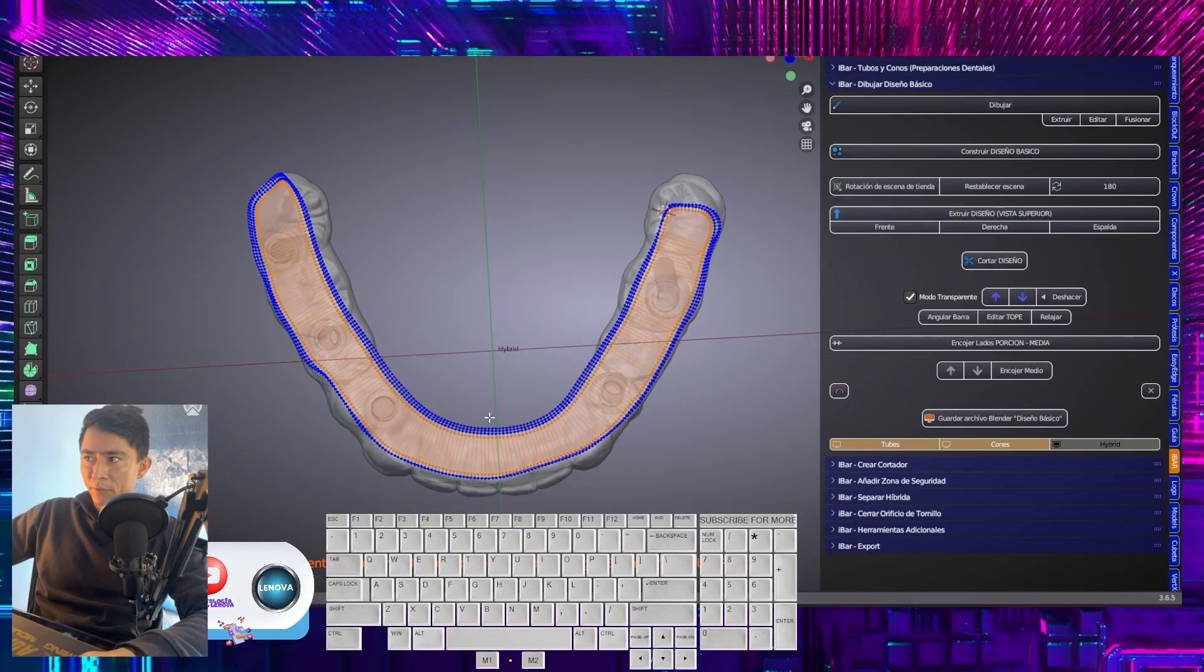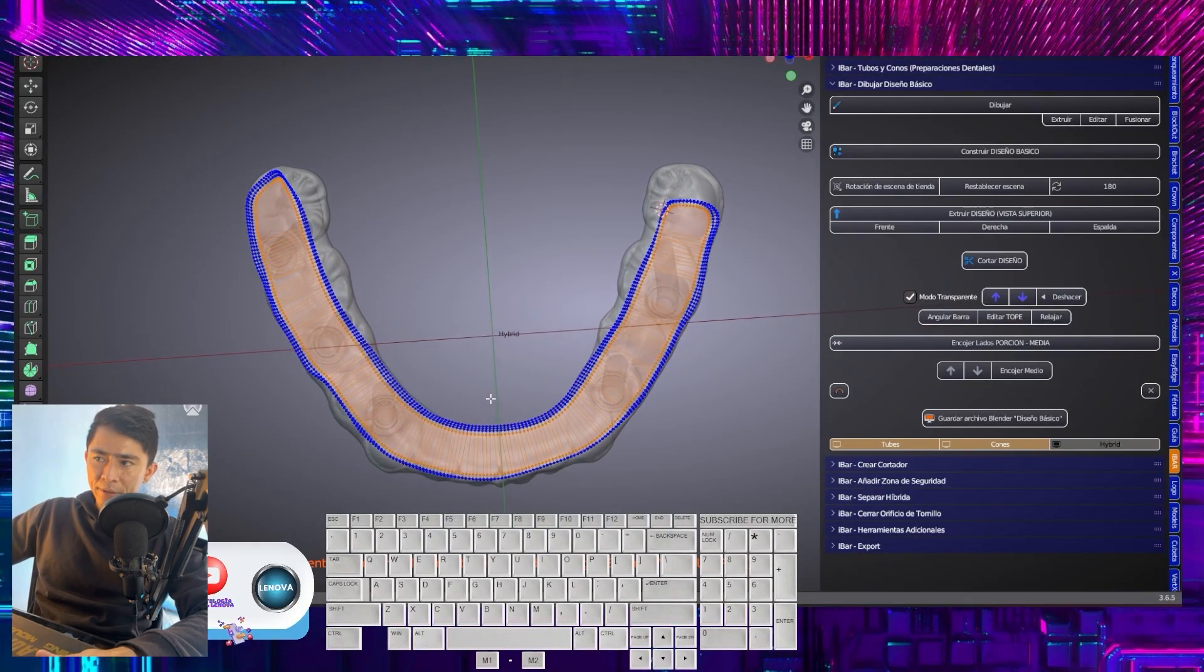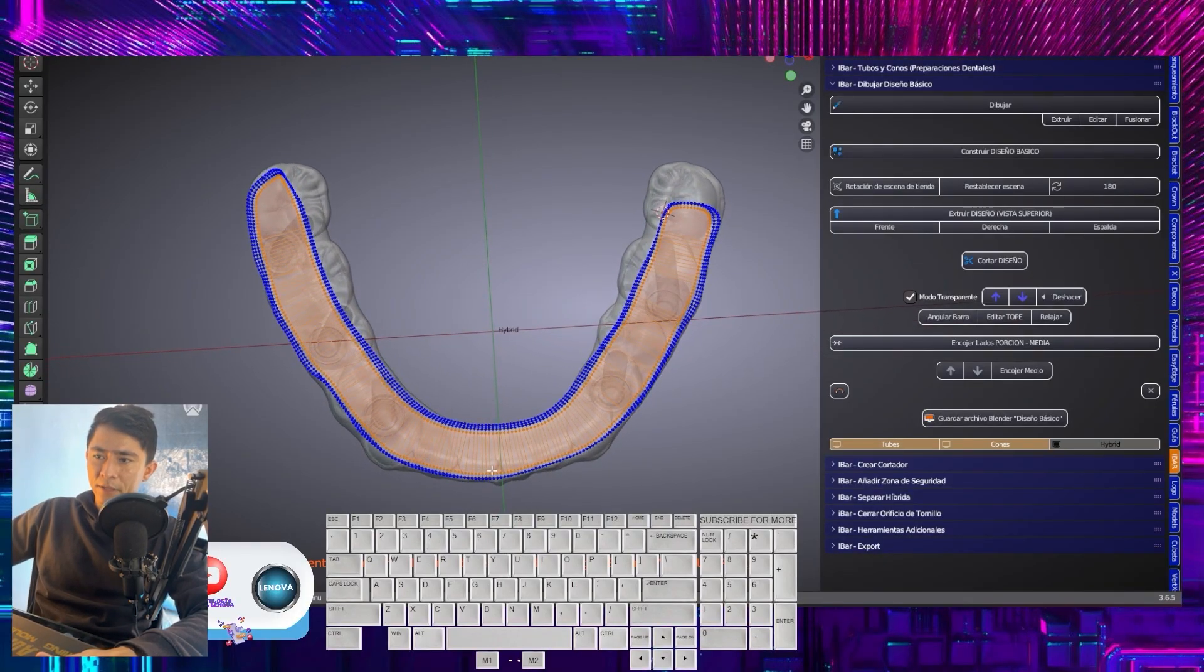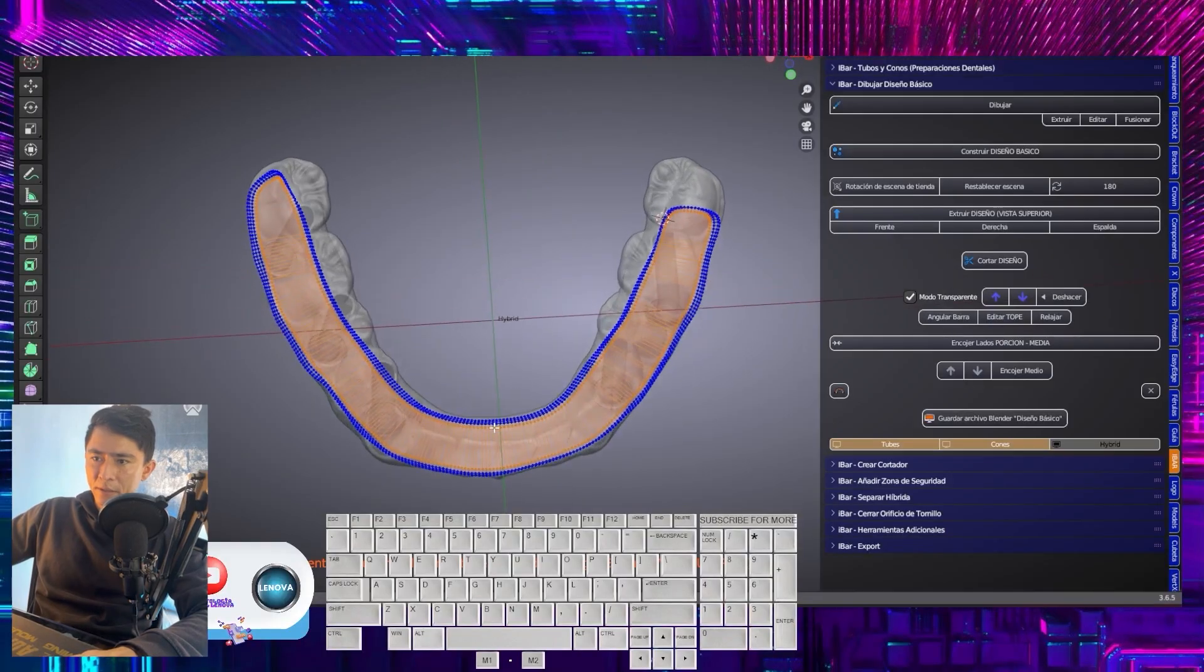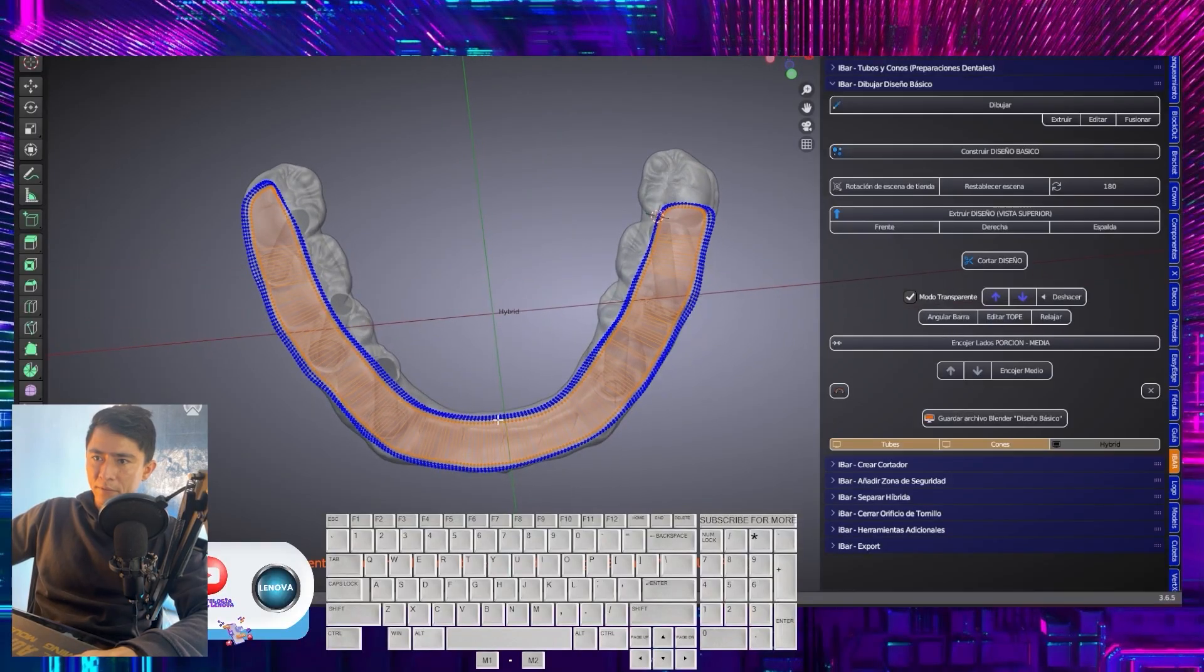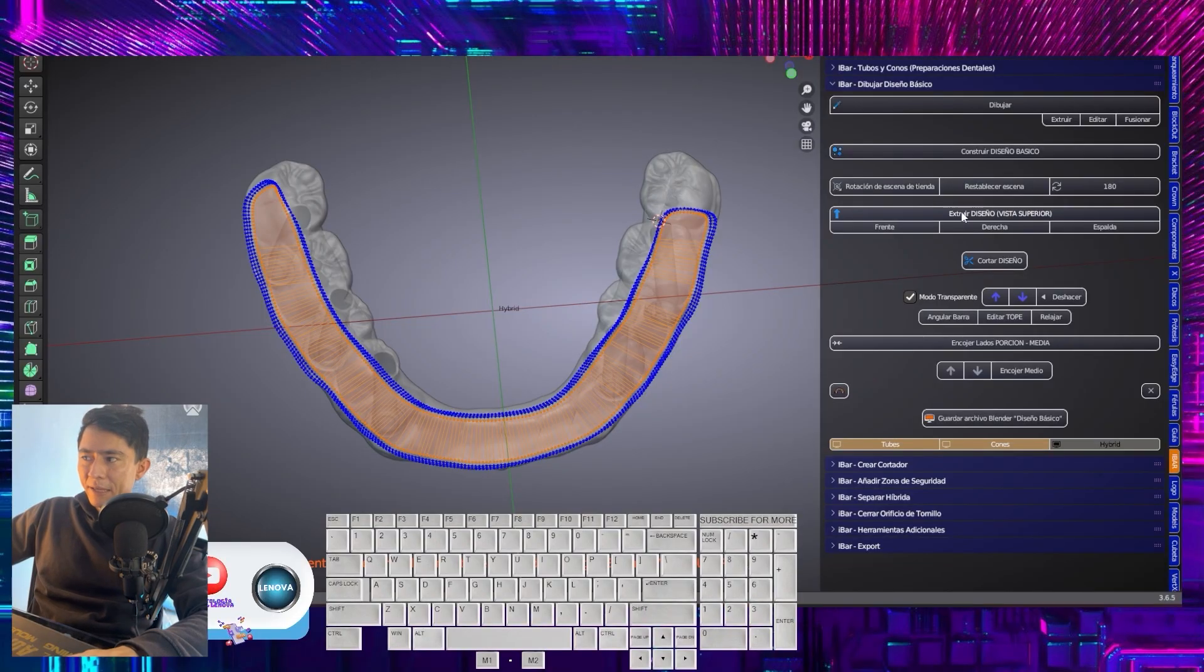Now, what I am going to show you is keeping that position, I will lean slightly towards the distal side. Like that. And now I select extrude basic design.